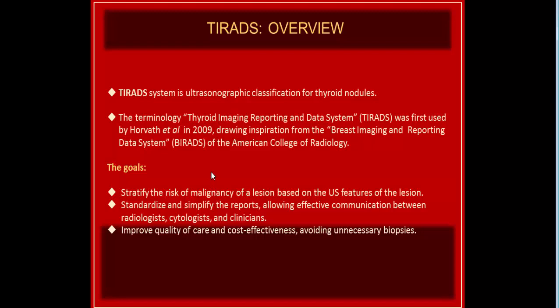TIRADS overview. The TIRADS system is an ultrasonographic classification of thyroid nodules. The terminology thyroid imaging reporting and data system was first used by Horvath in 2009, drawing inspiration from the breast imaging reporting and data system, BI-RADS, of the American College of Radiology. The goal is to stratify the risk of malignancy of a lesion based on its ultrasound features, and to standardize and simplify the report, allowing effective communication between radiologist, cytologist, and clinician, improving quality of care and cost effectiveness, and avoiding unnecessary biopsies.